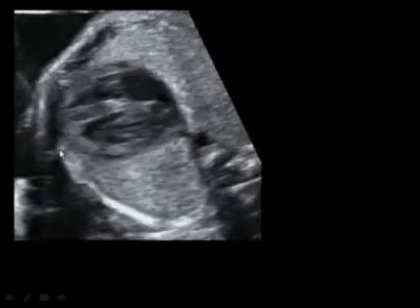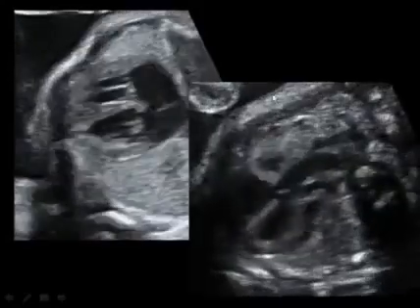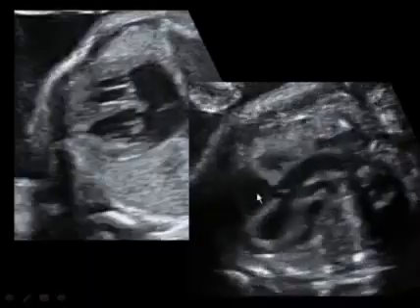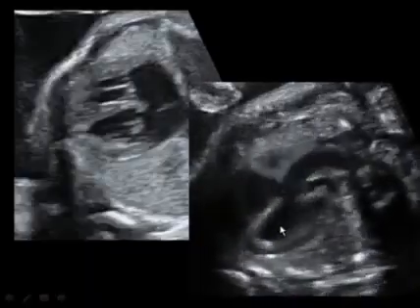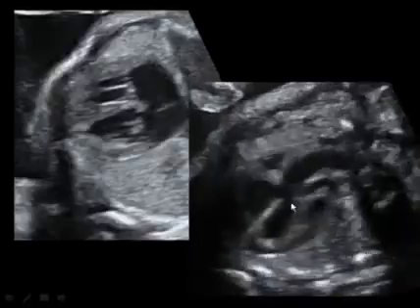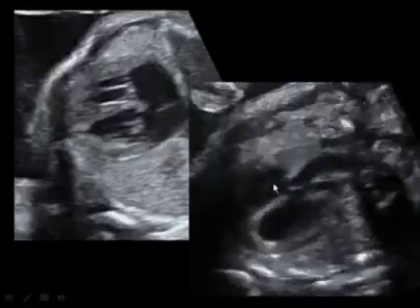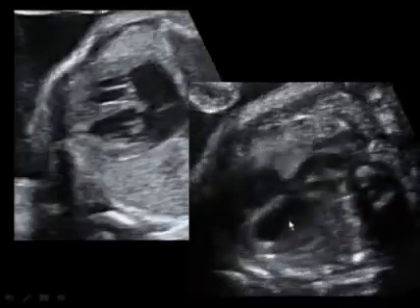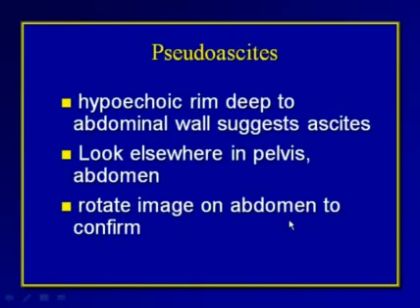Here's another patient. We see a four-chamber view. It looks beautiful. But when we look at the image of the aorta, we can see now, when we follow with both right and left ventricles on the image to see the ascending aorta, that there's an overriding aorta here and a ventricular septal defect, and we're then able to identify the overriding aorta in the tetralogy of Fallot.